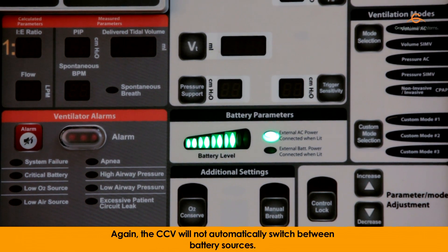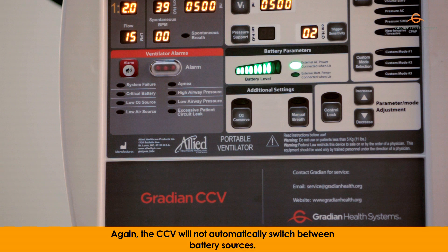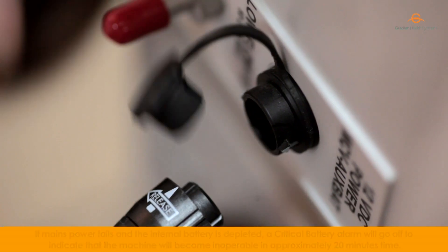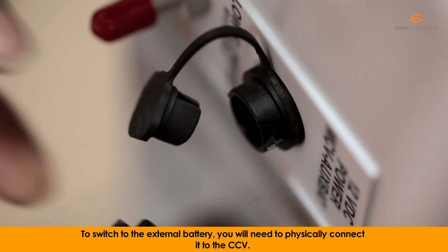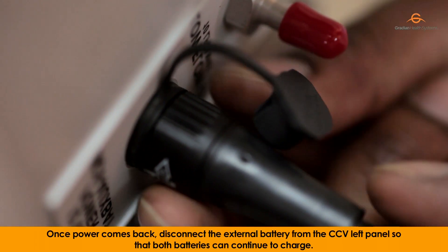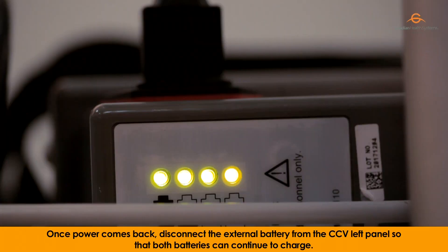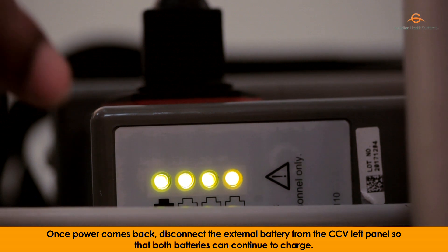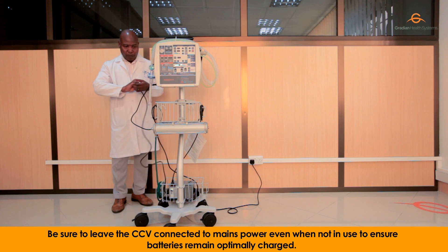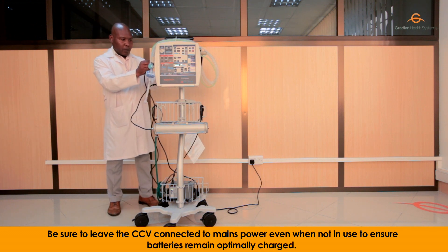The CCV will not automatically switch between battery sources. If mains power fails and the internal battery is depleted, a critical battery alarm will go off to indicate that the machine will become inoperable in approximately 20 minutes. To switch to the external battery, you will need to physically connect it to the CCV. Once power comes back, disconnect the external battery from the CCV left panel so that both batteries can continue to charge. Be sure to leave the CCV connected to mains power even when not in use to ensure batteries remain optimally charged.